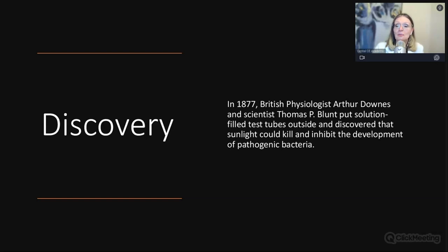And light is pretty amazing. We know we use light in other forms in dentistry. Photobiomodulation would be one of those, where we use light to help speed up healing, inflammation, also known as low-level laser or cold laser, but now can be performed with LED devices that are FDA approved for that purpose. So we know that light does exist to help in healing and kill microbes.